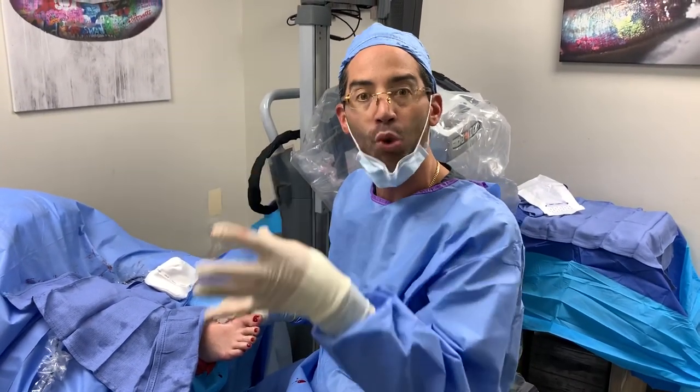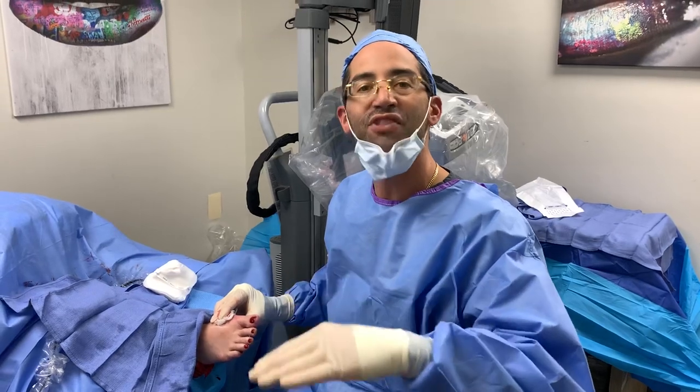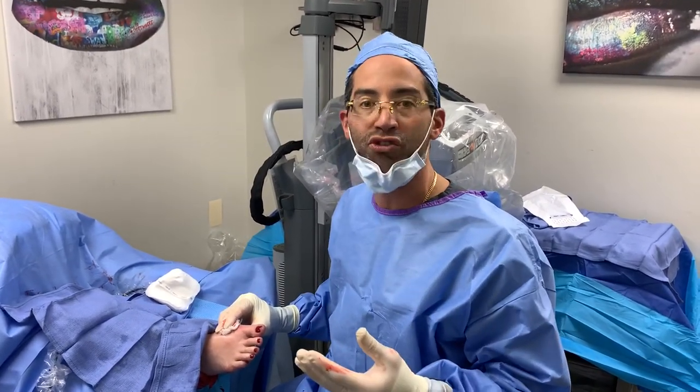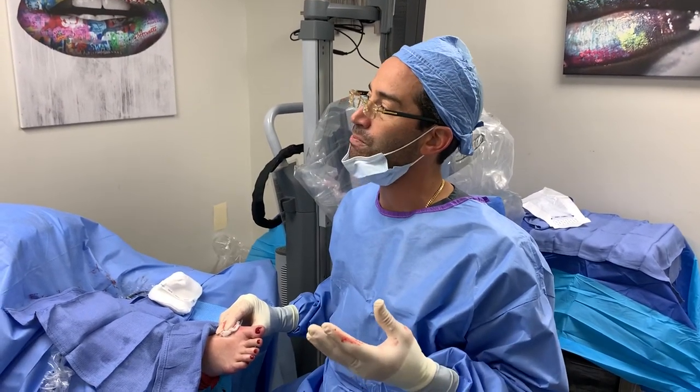The kylectomy provides the patient more range of motion. There's an accumulation of bone that develops on the top of the joint, and what we basically did was shave that down. It's a very conservative but yet effective procedure.